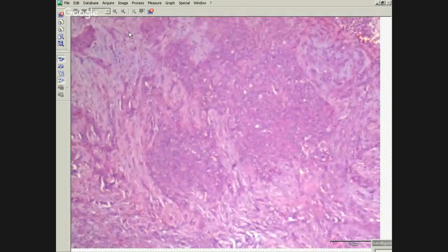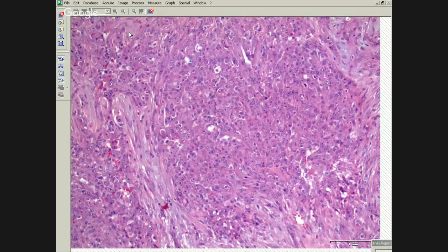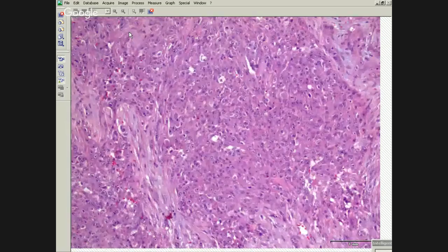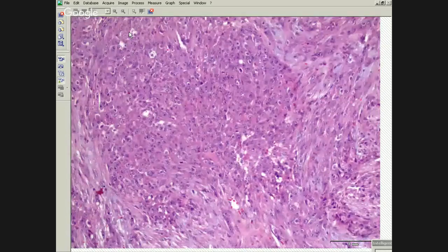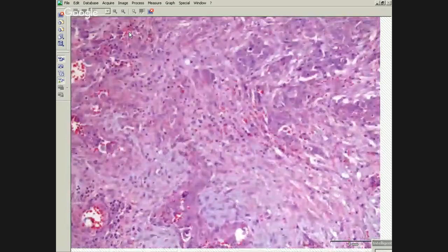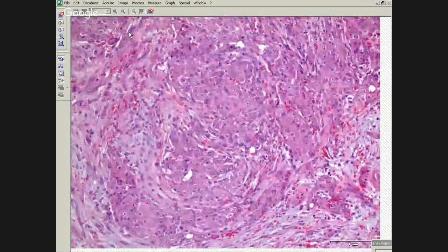Okay, looks a lot like the other one. Yeah. All right. And the cells in the squamous is something not here, but some areas. Okay. But here is like probably nucleoli. Okay, so we've got an infiltrating epithelioid tumor, kind of ugly cytology, big nucleoli, a few mitoses around. So what are we thinking? Mesothelioma.